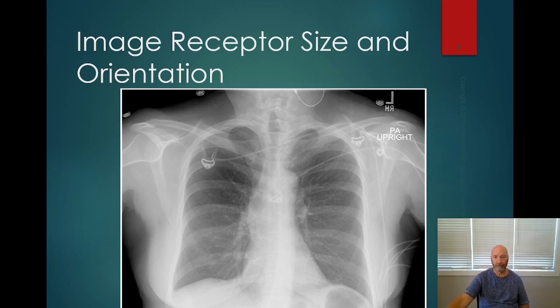If just looking at this, we can look at a couple of other things. If we're looking at the patient's shoulder, the evaluation criteria for shoulder is to include everything from the proximal portion of the humerus down to the bottom of the shoulder blade and all the way over to the medial end of the clavicle. So entire scapula, entire shoulder girdle, all the way over here. But this distance is longer than this distance, and therefore we would need a 10 by 12 crosswise for a shoulder.